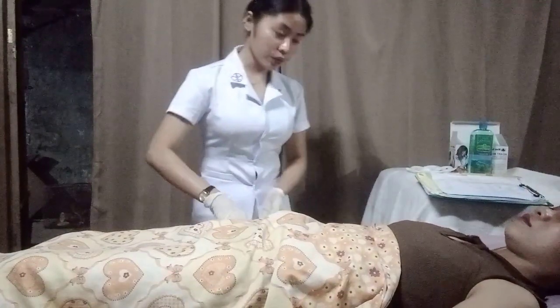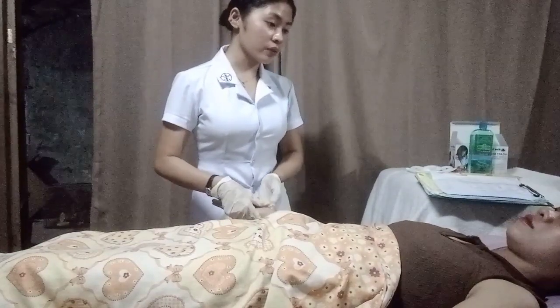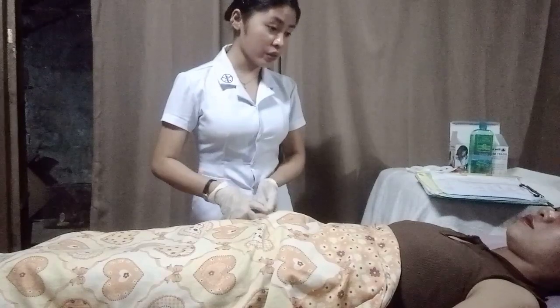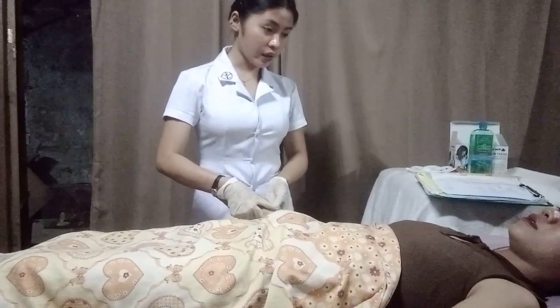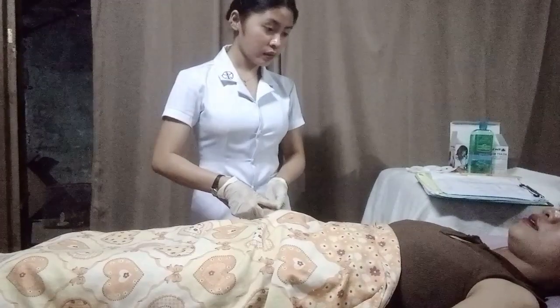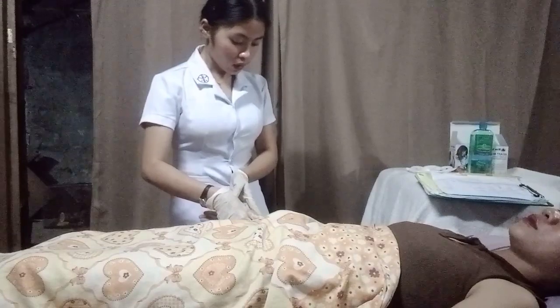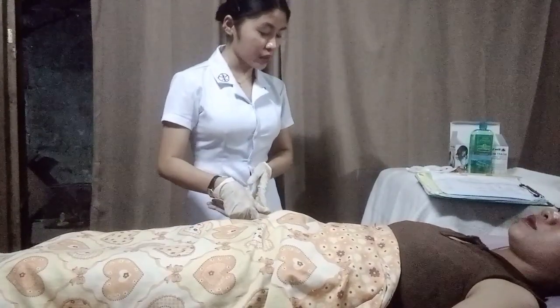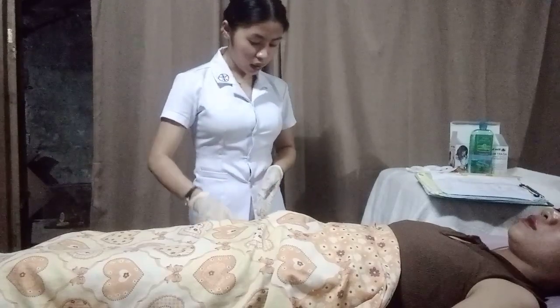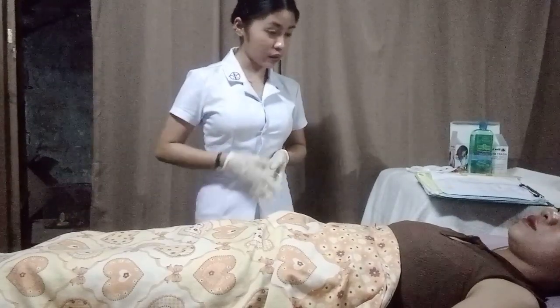So, good morning ma'am. My name is Junamisi Ontoa, your student nurse for today. And what is your name? My name is Sunny Jean M. Castro. And your age, please? 20. And your birthday? June 23, 2002. Okay, ma'am. So your Dr. Melendez has prescribed you morphine to alleviate your pain. Is it okay?